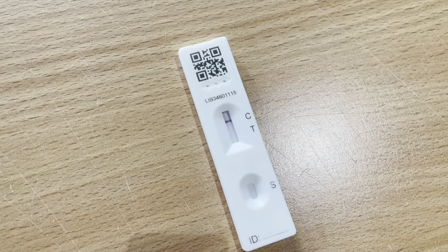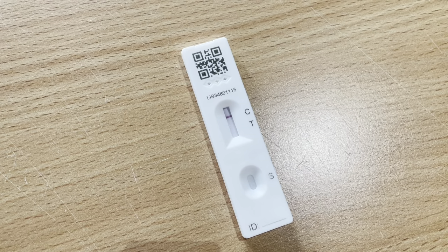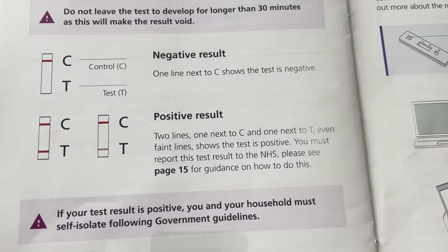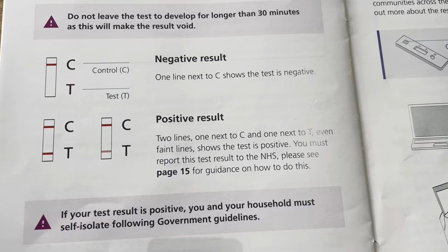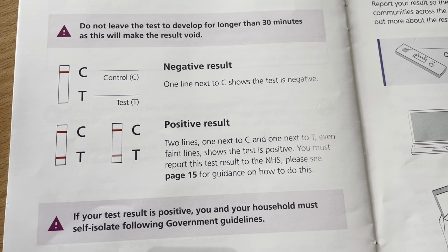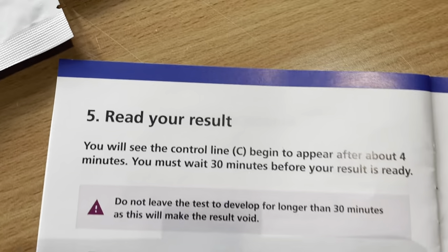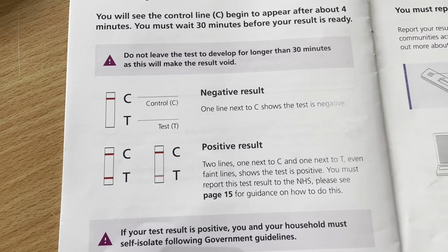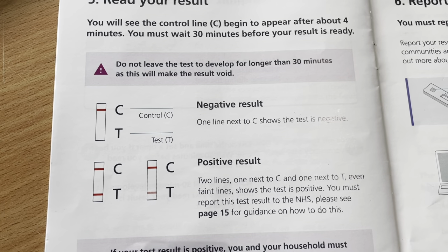After 30 minutes, this is what a negative test should look like — you've got one line on the C. If your test is positive, you'll have two lines: one next to the C and one next to the T. Even if it's a faint line, this shows the test is positive. So the top is a negative result — one line — and the bottom is a positive result — two lines.